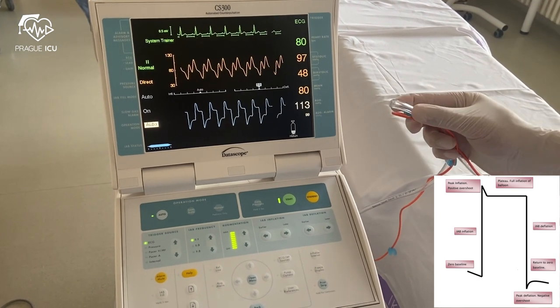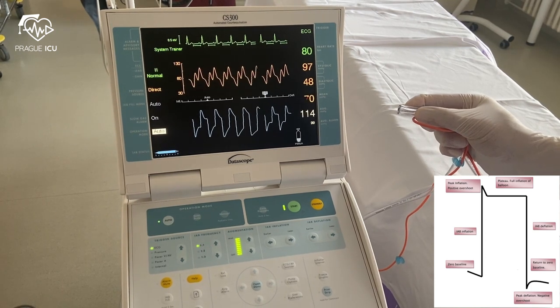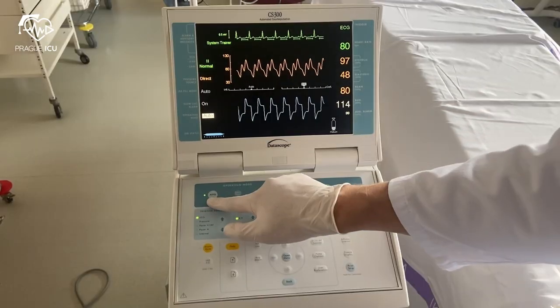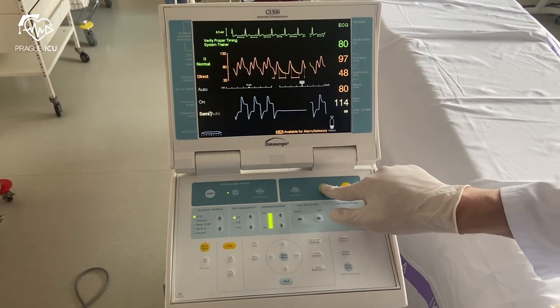If the catheter is kinked, a rounded balloon pressure waveform with loss of plateau will appear. In semi-auto, you can also change the inflation and deflation settings.